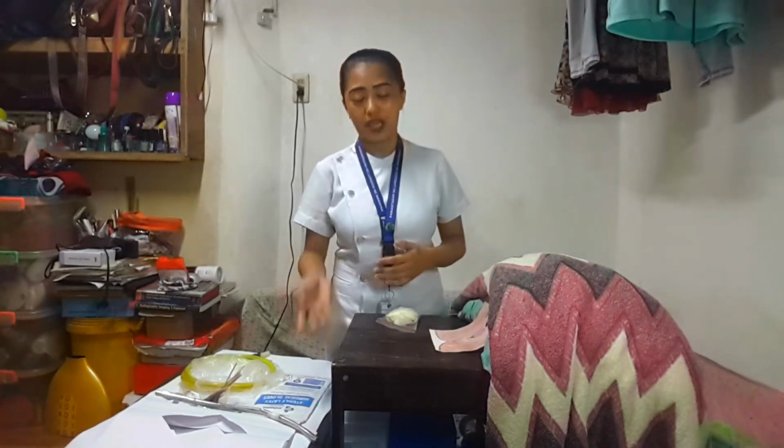For this procedure, we need first to assess the client's need for catheterization. We need to review the medical record for any medical or pathological condition that may impair the passage of the catheter. Also, we have to be aware of any record of allergies of the patient because it will affect the catheter insertion. We also need to know the age and gender of the client, and we have to verify the doctor's order so that we will know if we're doing the right procedure to the patient.